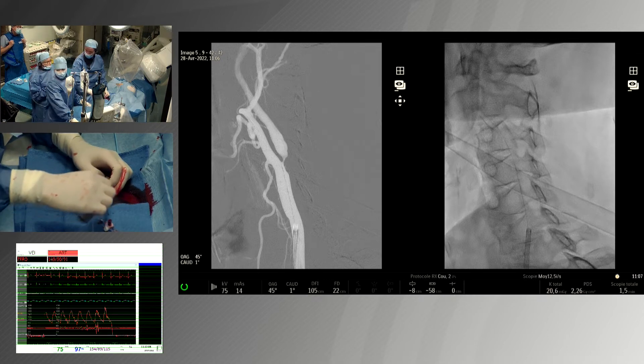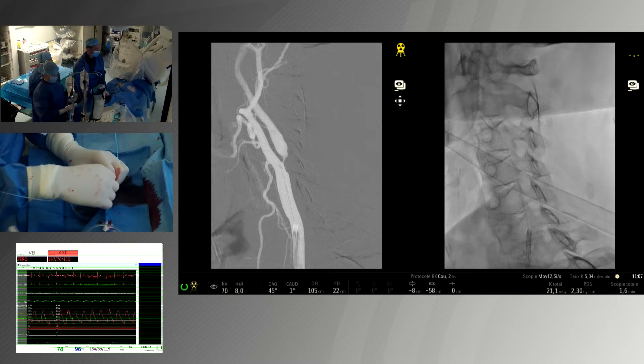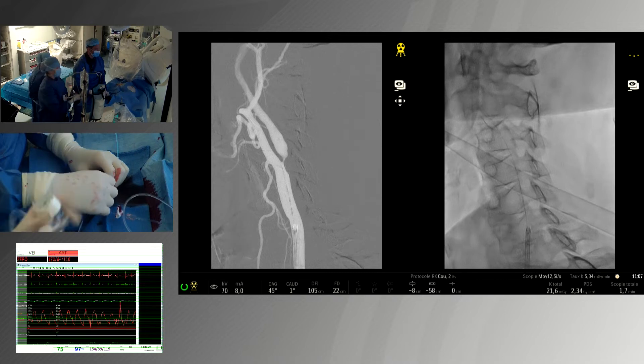We wait for injection of atropine — usually one milligram. Here the pressure is quite good, it is 140. We are going to pre-dilate.